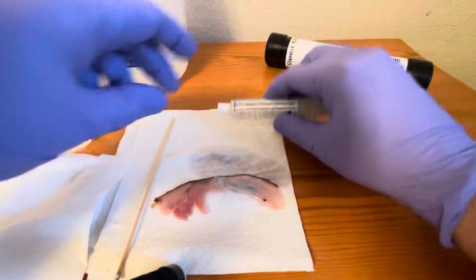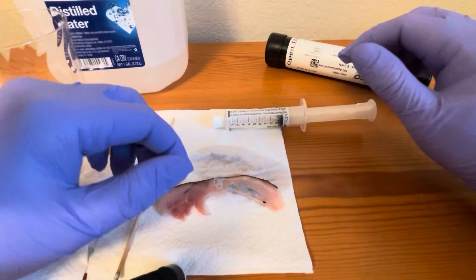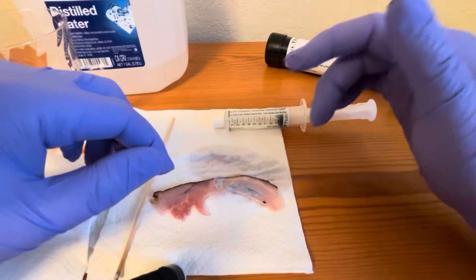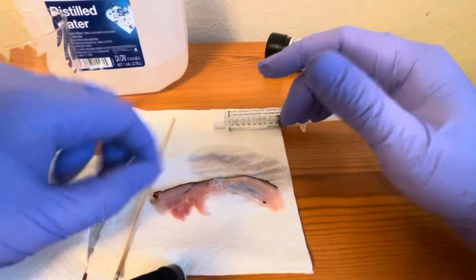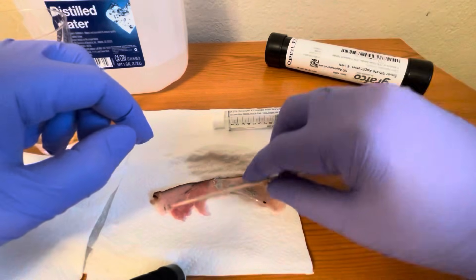That stain will remove in a couple of days, sometimes up to two weeks, so not to be concerned. Overall, you might have to use the silver nitrate sticks a couple of times for it to fully remove the granulated tissue — just be cautious and wary of it.